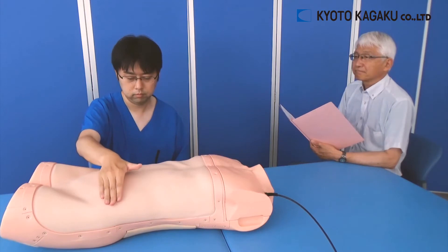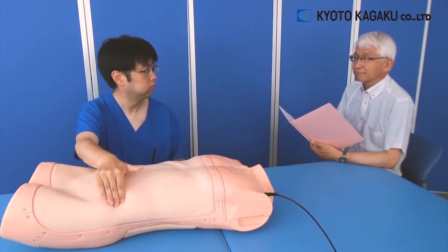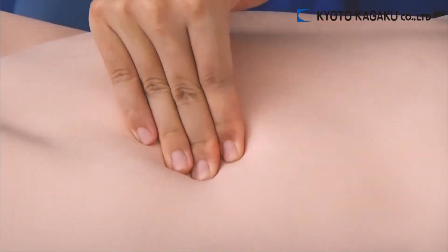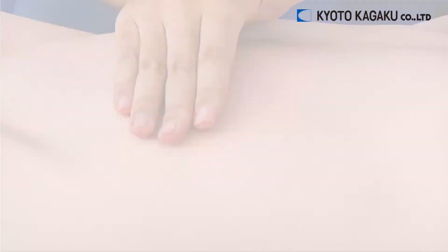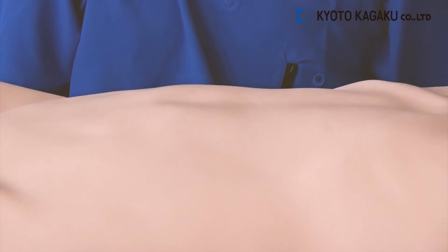You are looking at the Abdominal Examination Simulator, Abdo Abbey, from Kyoto Kagaku. This Abdominal Examination Simulator uses a new material which has a soft feel that is almost consistent with the human body. By stepping on the air pump, one can reproduce abdominal breathing.